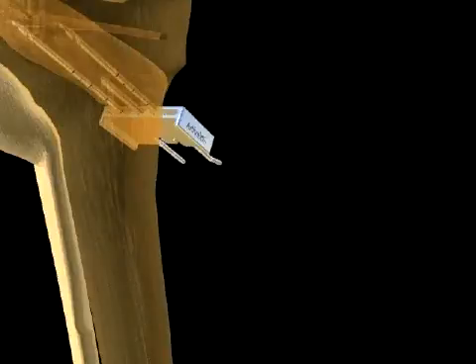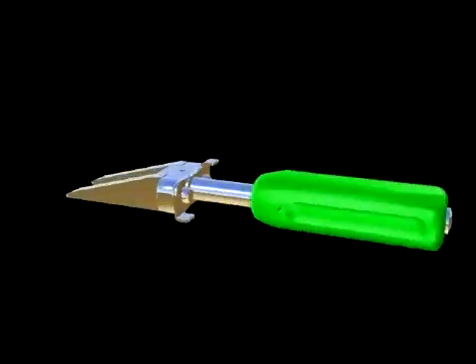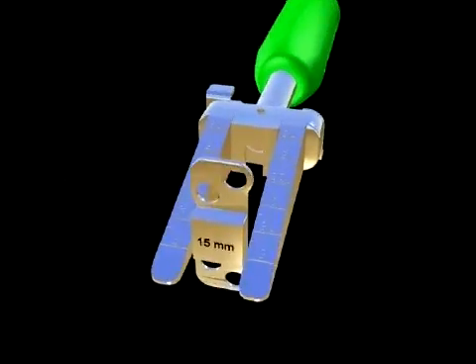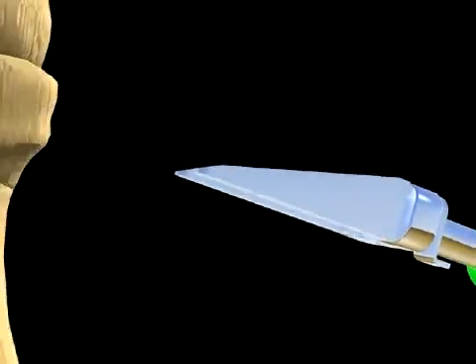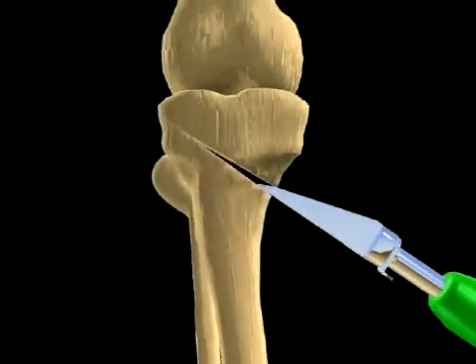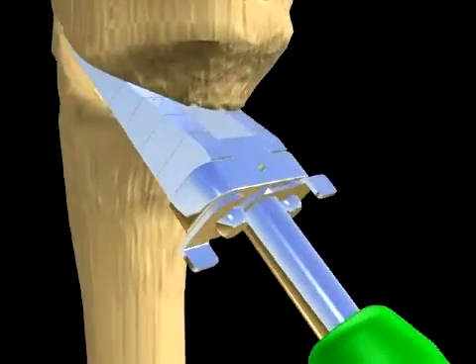The cutting guide and guide pins are removed. The osteotomy wedge is assembled as shown. When the desired opening has been achieved, alignment is verified externally from the hip to the ankle, as well as by fluoroscopy, to ensure the weight-bearing line is through the lateral compartment. Adjustment to the opening may be accomplished by impacting or extracting the wedge to the next appropriate size.